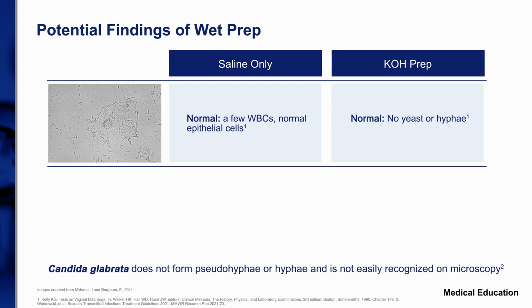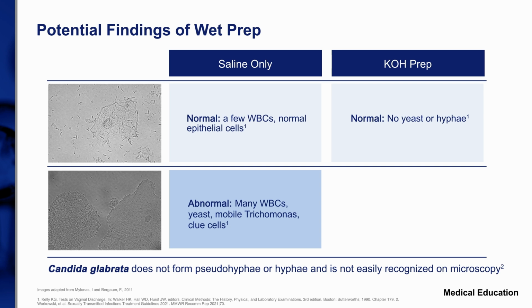White blood cells are not present or usually will be very low in number. In the case of bacterial vaginosis, clue cells are the single most important predictor of vaginitis, where you can see vaginal epithelial cells covered with many vaginal rods and coccobacilli, creating a granular appearance. In symptomatic women with Trichomonas vaginalis, saline wet mounts can show the motile trichomonads and large numbers of white blood cells, more than 10 per high power field, and also epithelial cells can be observed. In patients with vaginal candidiasis, a potassium hydroxide prep test can reveal hyphae and budding yeast forms. But this is usually best for Candida albicans and not other species of Candida.